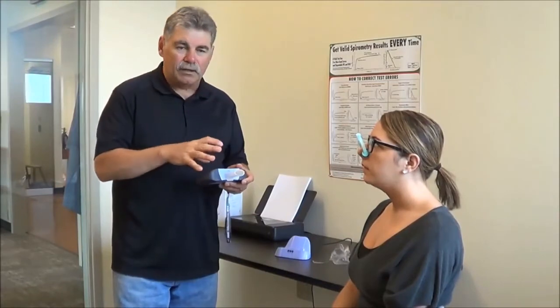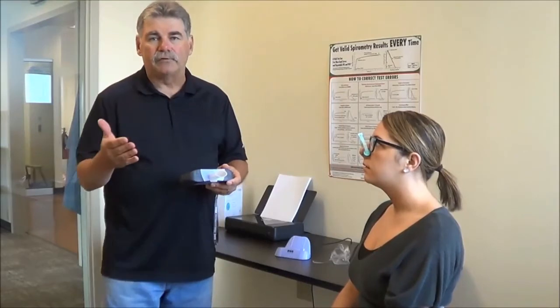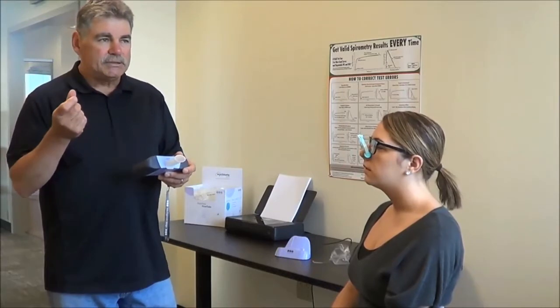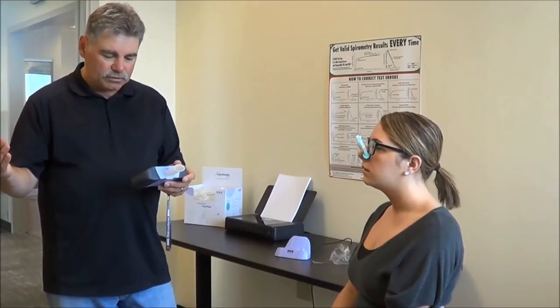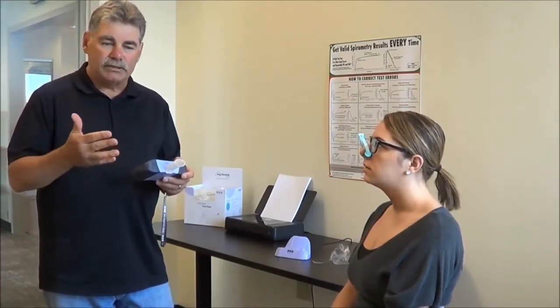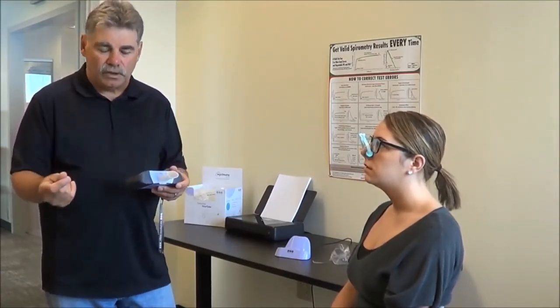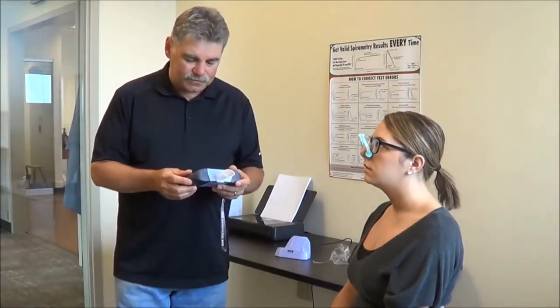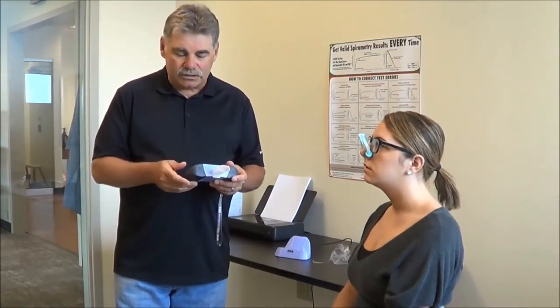Now, the other aspect of quality in the software of the device is we have a grading system in here, an A through F grading system like school grades. So what we're grading on is the acceptability of the blow, whether she started nice and fast and continued to go until no more air, and reproducibility. In spirometry, it's important that we get these three acceptable trials, but they also need to be reproducible. The FVC and the FEV1 ideally need to be within 150 milliliters of one another. So we have a grade displayed here that's telling me where I stand with regard to quality.